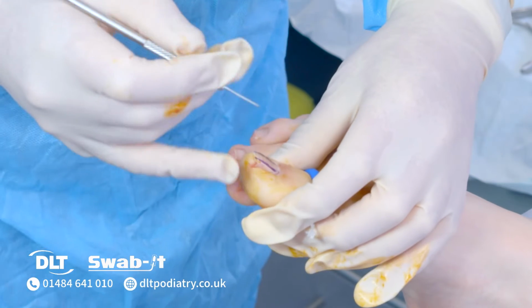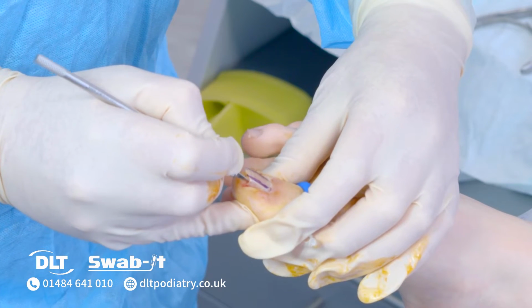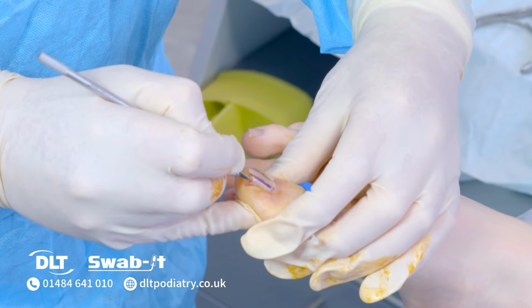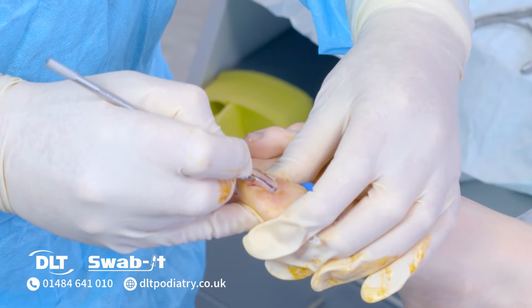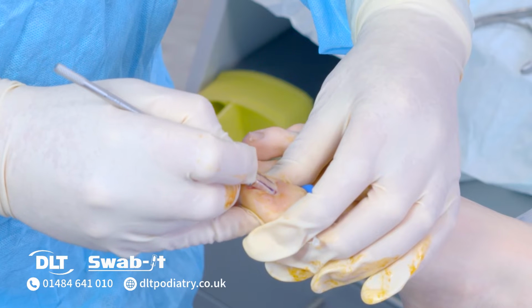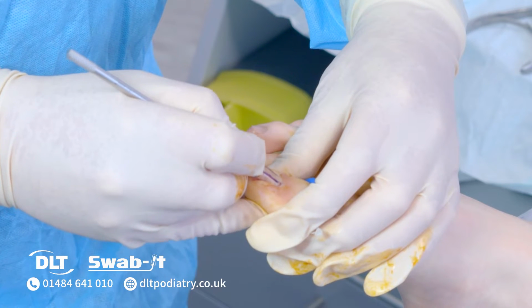So you've got a chisel blade. You run along the course of where you've cut, and you just gently, with the chisel, go under the eponychium. And you wait to feel it give.